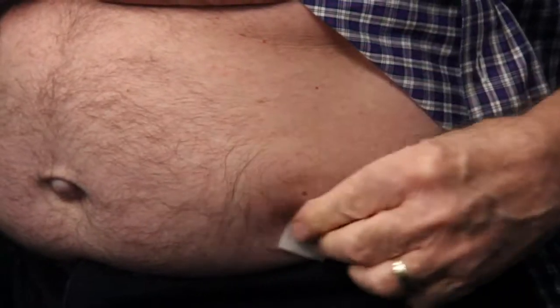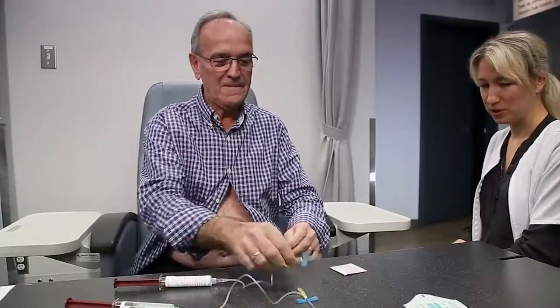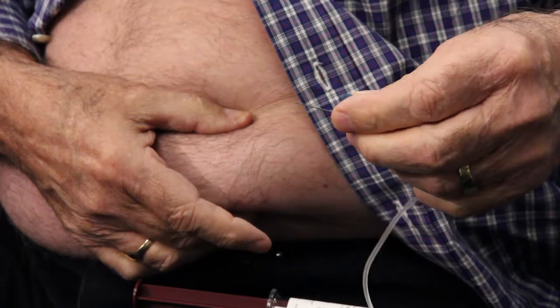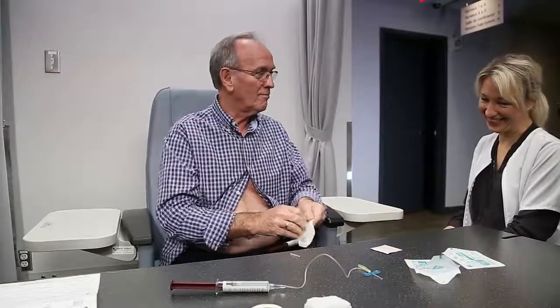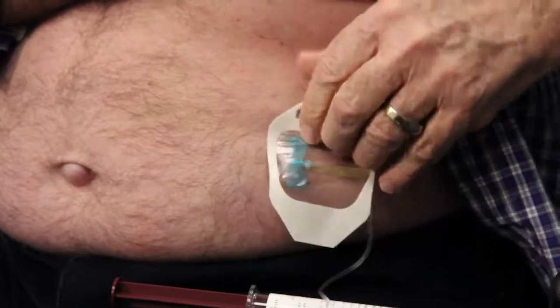Disinfect your skin with an antiseptic swab and let it dry completely. Using two fingers, pinch the skin, avoiding the disinfected area. Angle the needle from 45 to 90 degrees. Using a swift motion, insert the needle completely, and secure with medical tape or transparent adhesive.